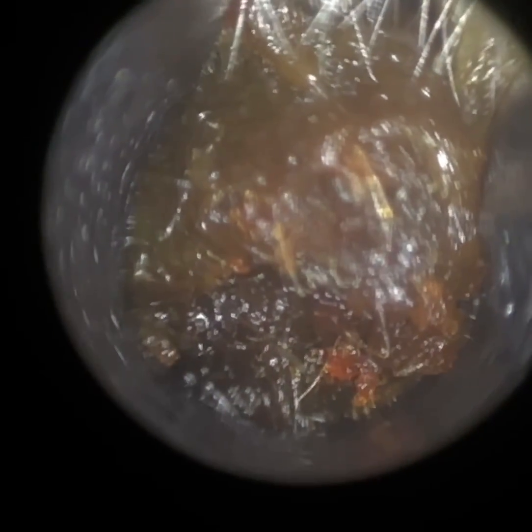This is their right ear, and this ear is a lot more narrow at the entrance. I'm just using the 4.25mm speculum to widen and dilate this patient's ear canal entrance. It was the entrance and mid-canal where it was quite narrow, and then it widens again. You can just see there — we're trying to stretch the ear open.